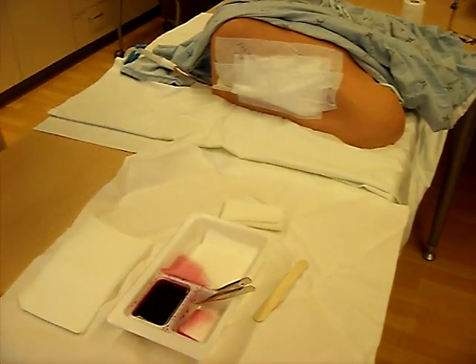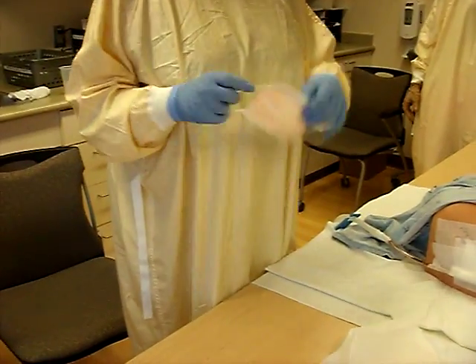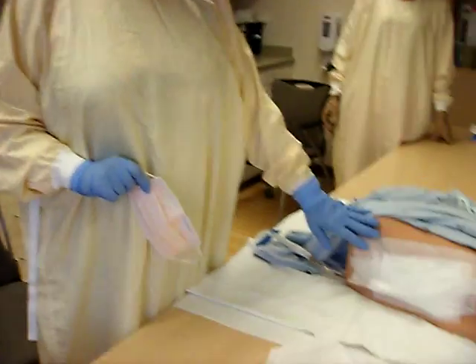So, equipment includes a waterproof gown in case there's any splash from the chest tube removal. You'll also need to wear a regulation face mask because this is a sterile procedure.